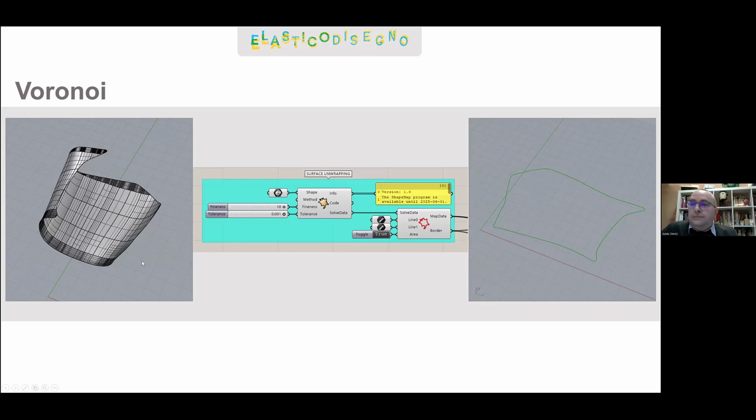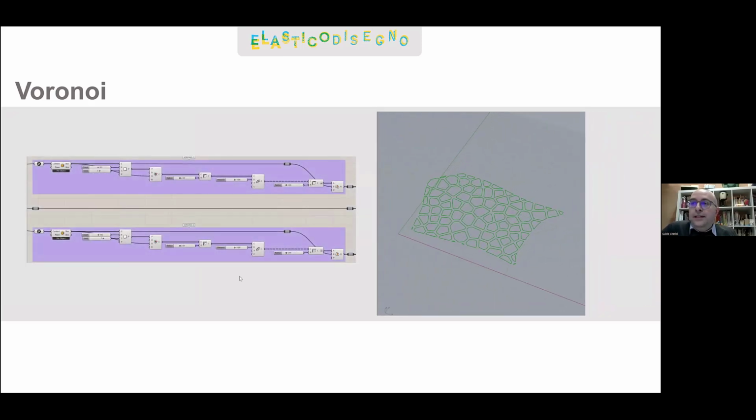So we again used Shape Map to unwrap the surface and to get its outline. In this case, here you see a solve data node with 2 lines, which we used to define the scale and the position of this unwrap. Then we defined 2 different Voronoi patterns, because, as we will see in the final renders, they had to reduce the size of the holes in the cover but still keep it light. We generate 2 different sets of Voronoi patterns. One that we use to make holes towards the outside of the hand, and one towards the inside. We'll see that better later.